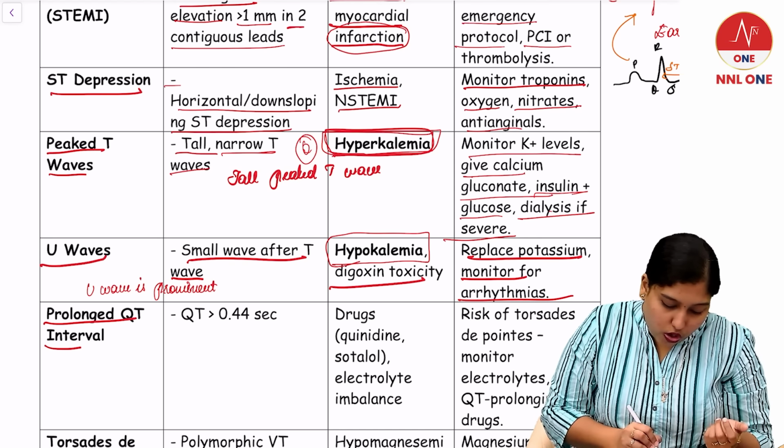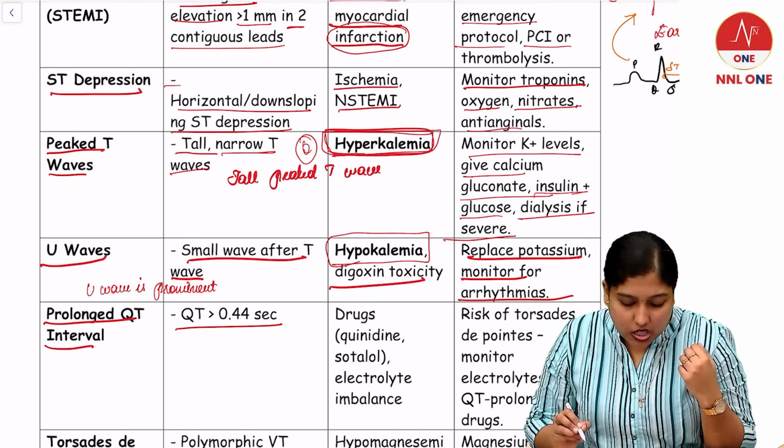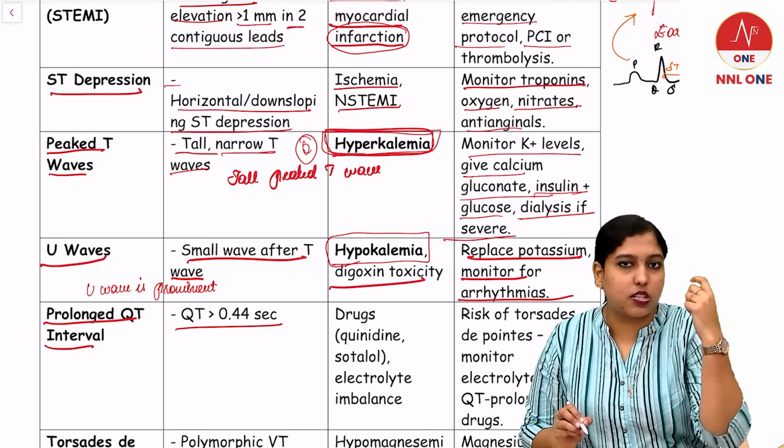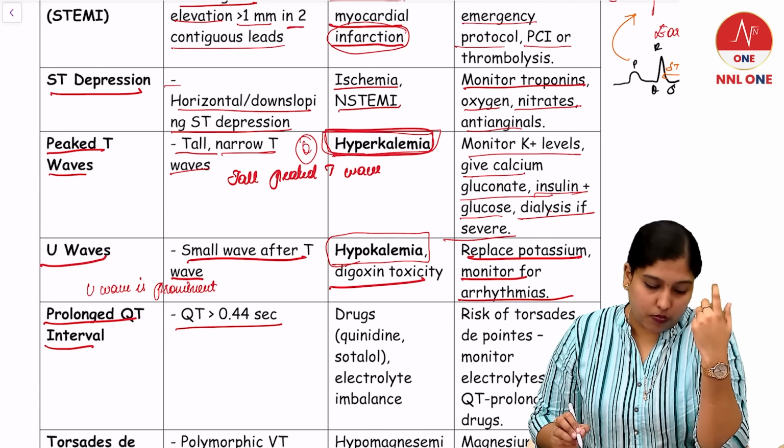Next, we have prolonged QT interval, which is seen in many conditions. We will discuss in pharmacology all the areas where you see a prolonged QT interval.